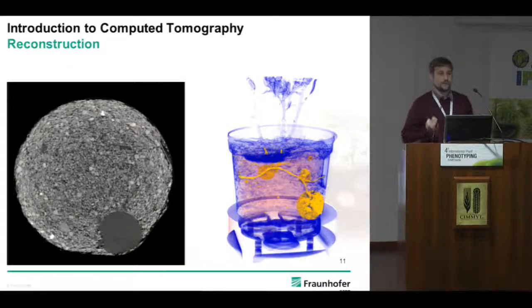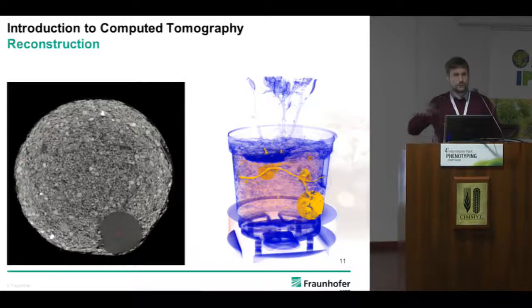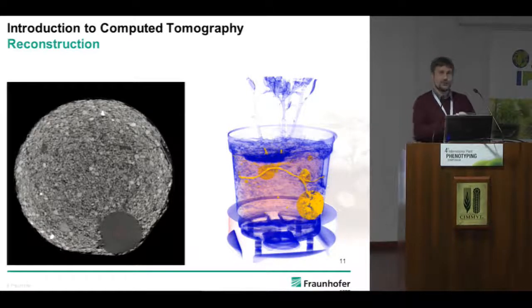So what you have is a tool measuring mass, the mass of an object within your pot. Of course, a stone has a completely different atomic composition, so this you cannot compare, because therefore you need to correct for the atomic elements in there.